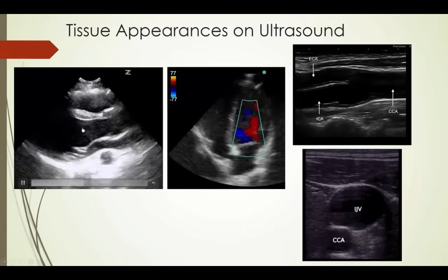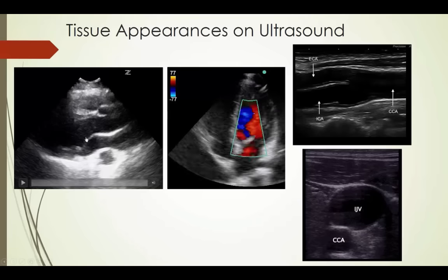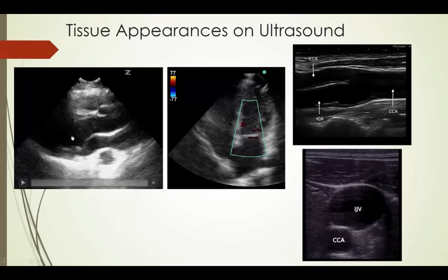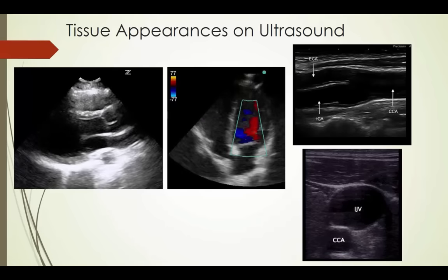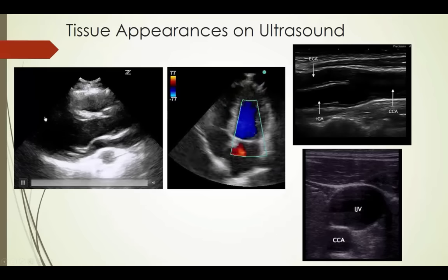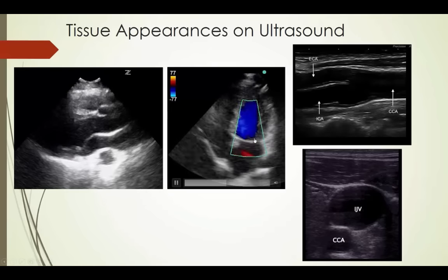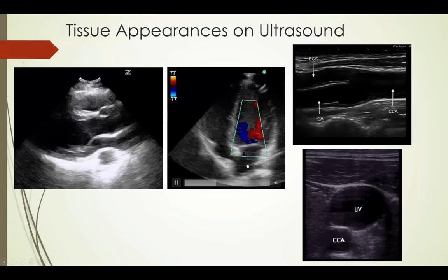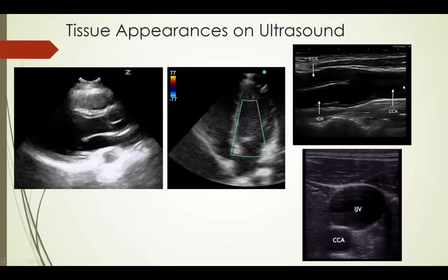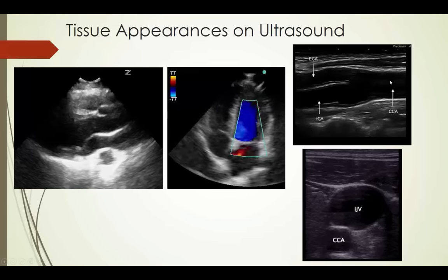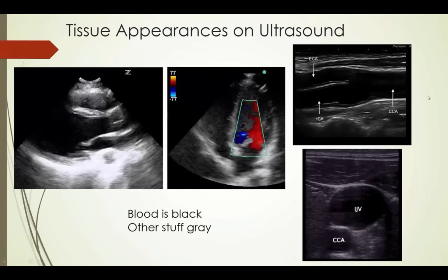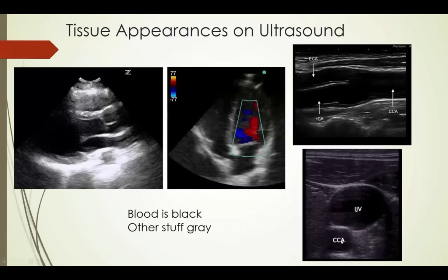A little about what these pictures look like. This is the heart — the left ventricle, with the mitral valve and the aortic valve. The blood inside the left ventricle is black. That's all I really want you to know: blood looks black, other stuff is some shade of gray. Here we're using color Doppler to see blood flow moving through the heart. Here's the carotid artery — the common carotid branching to the internal and external carotid. Blood inside the artery is black. Internal jugular vein and carotid artery in cross-section.